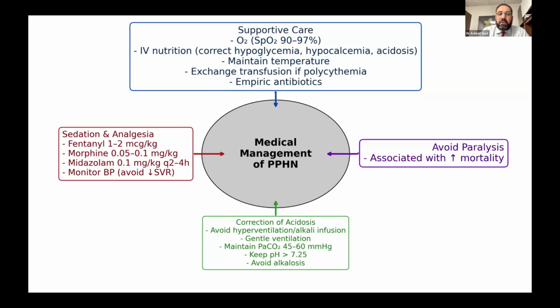Of those babies, ventilation: how to start ventilation, what sort of ventilation you start, conventional versus high frequency. It depends on the NICU, but once those babies require very high pressure, have evidence of meconium, or are using inhaled nitric oxide, it's preferable to use gentle ventilation or high frequency ventilation.